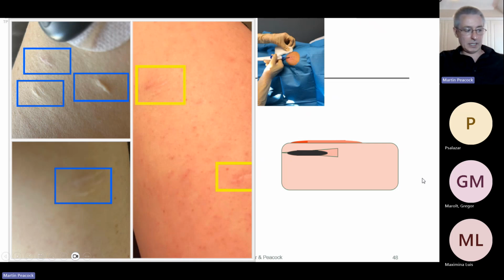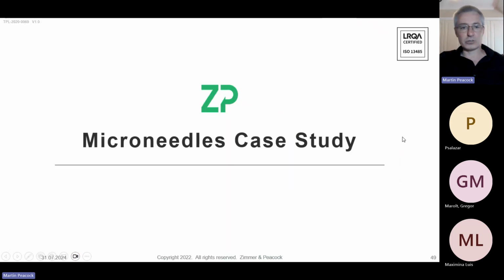So when I said where the real innovations will come, probably the smaller you can make this, the smaller these kinds of marks could end up being, in my opinion. If you're really trying to be cutting edge, then maybe implanted, and maybe making it as tiny as you possibly can. If you do it, please do it by electrochemistry, because the glucose oxidase enzyme, for example, is really robust and really specific.